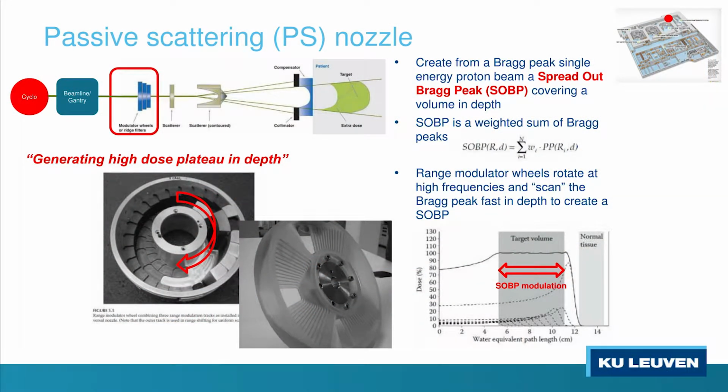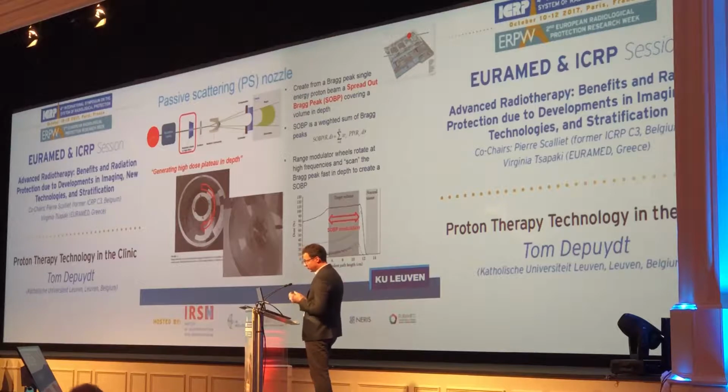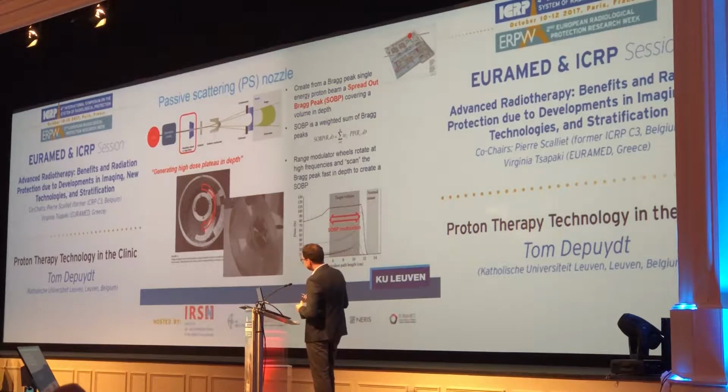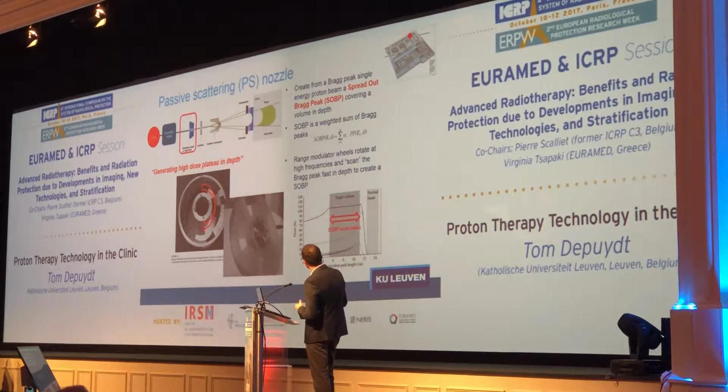A technique with which still most of the patients that have ever been treated with proton therapy is treated is passive scattering. There we create a wide, broader beam to irradiate volumes of the size of typical tumors, or target volumes at least. What do we do? We have the very sharp Bragg peak in depth, but we need to create something with the dimension of a tumor, a kind of plateau, and that's what is happening with this range modulator wheel. That's actually a piece of material shaped like this, that is rotated at a very high speed, and with this we can create this kind of plateau of high dose, whose size is nicely matched with the size of the tumor in depth. So we put some material in the beam.